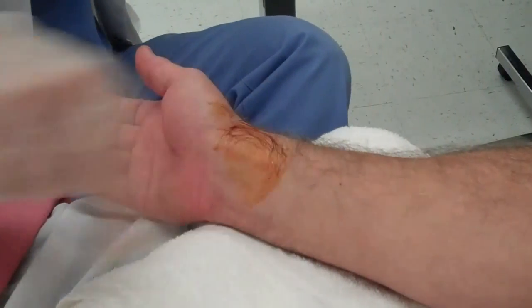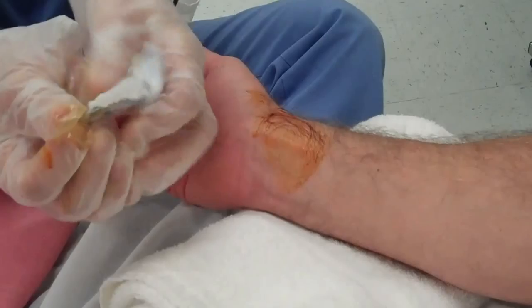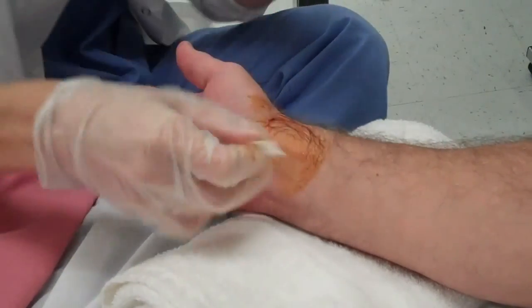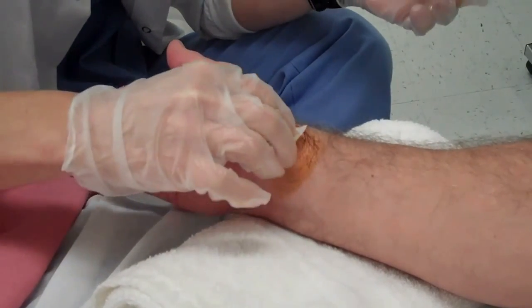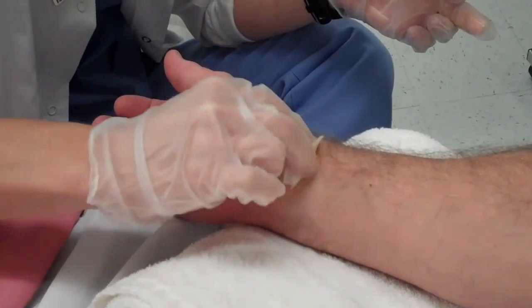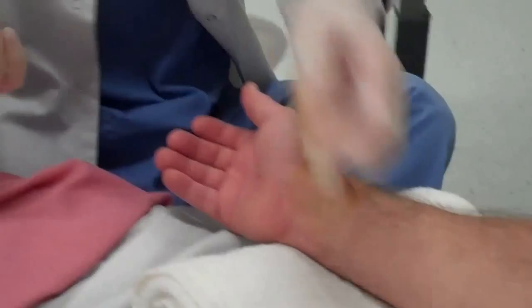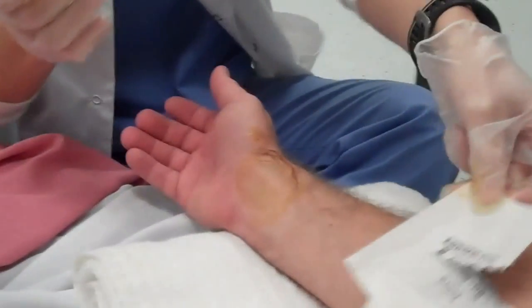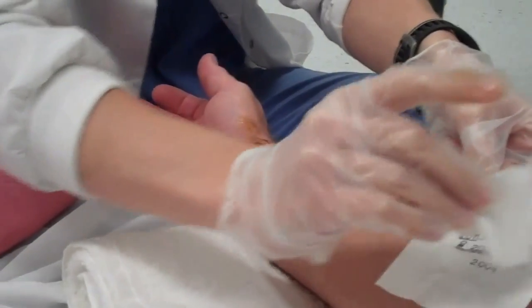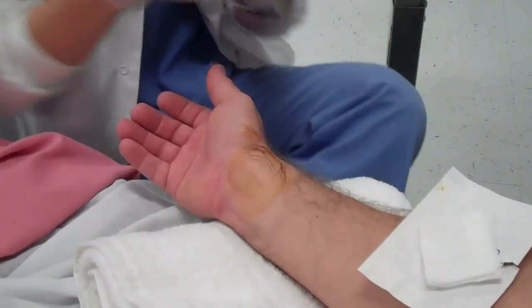A nurse is going to be angry with me already because I'm splattered. I'm going to take my alcohol and open it — same motion, starting in the center and working my way out. I now have my gauze where I can find it. Be cautious with laying it in the linen; it is white and it will blend, so be careful.